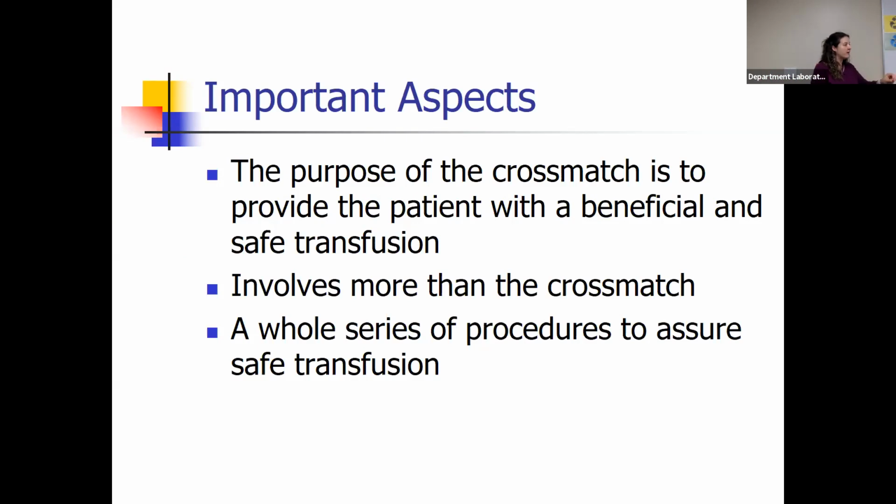Part of being a safe product is meaning that it is compatible with your recipient and that it will not cause any adverse reactions, okay? That's everything we do in BloodBank, to try to reduce the amount of adverse reactions that your recipient is going to have, all right? And so when you say cross-match or compatibility, you're thinking about how the recipient is going to receive that donor unit, right? And if it's compatible, that means your recipient antibodies will not attack the donor red cells, okay? So that would be a compatible unit, safe for transfusion.